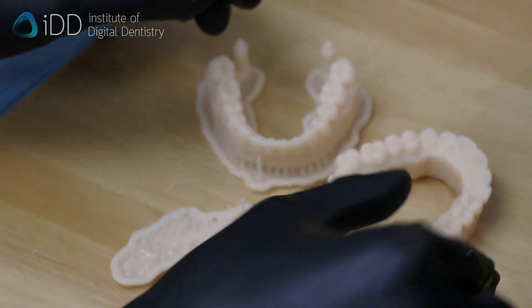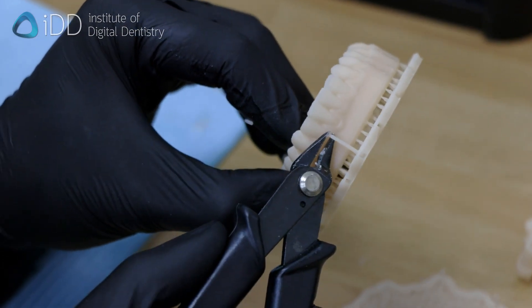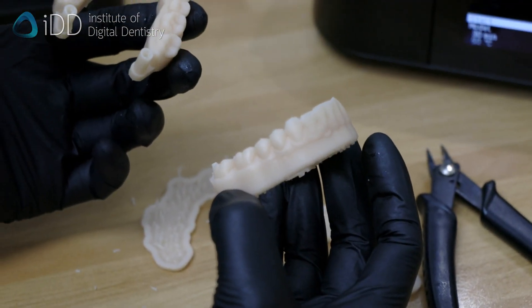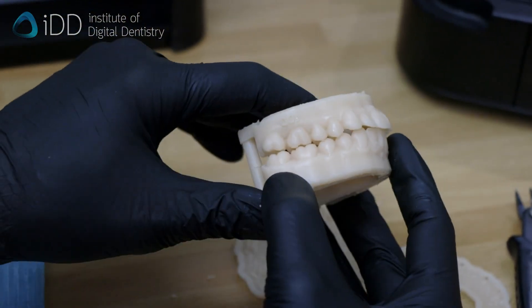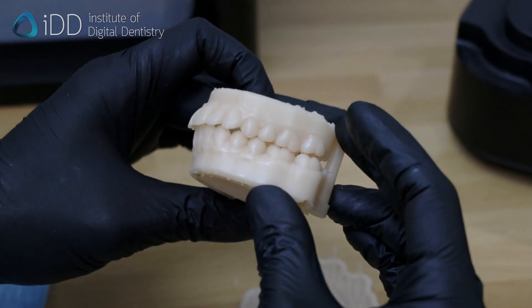Lastly, the supports are removed. With any resin you are printing, you need to make sure to follow the manufacturer's guidelines. Your models are now ready. These can be used for a variety of things, such as thermal form appliances or transferring wax sets into the patients' mouths for smile design cases.